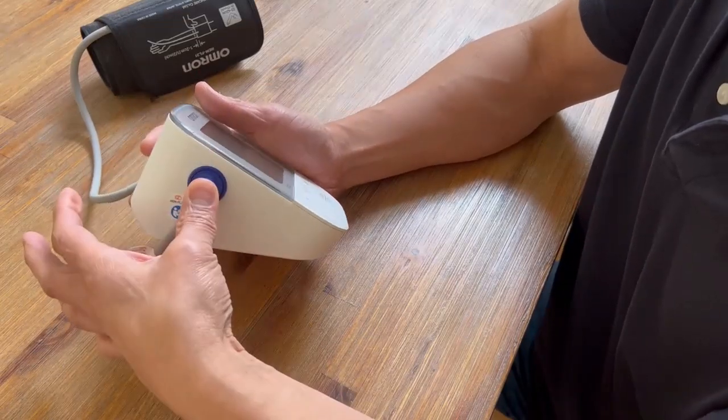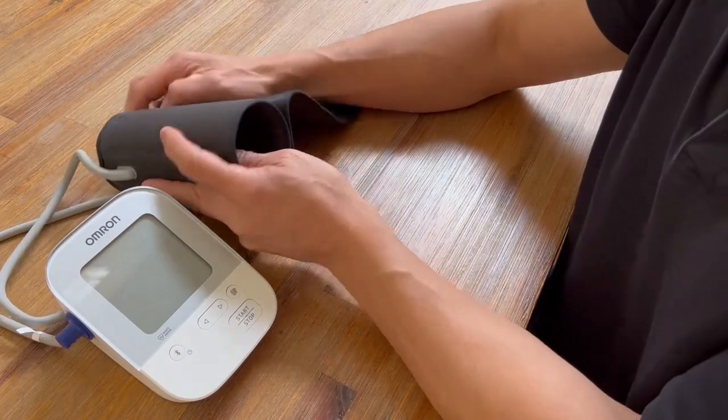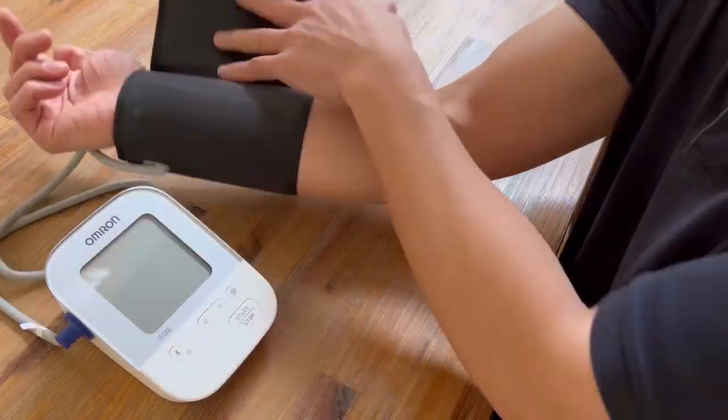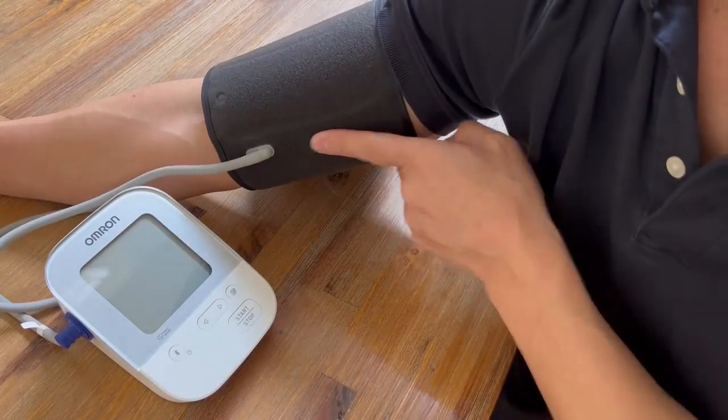Here I am with the air plug in there. You've got to hear that click, and then proceed to put the cuff on the arm. Make sure that the air plug is on the inside of your arm, pointing downward.